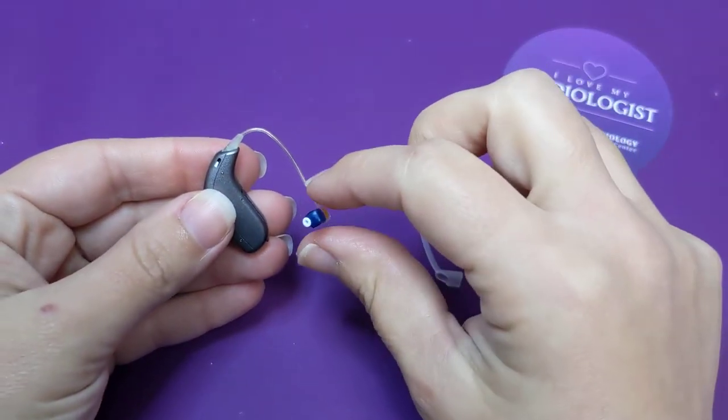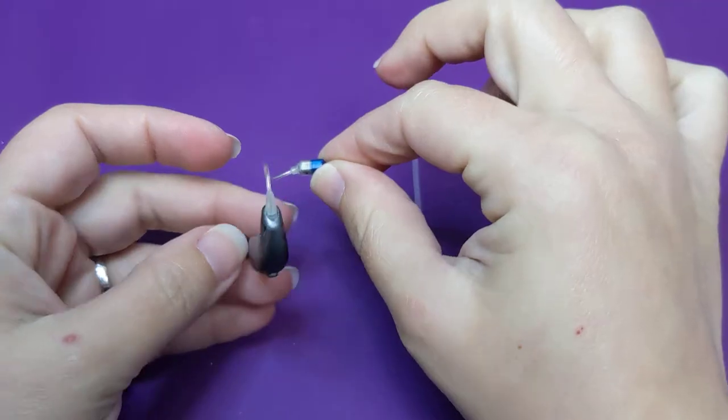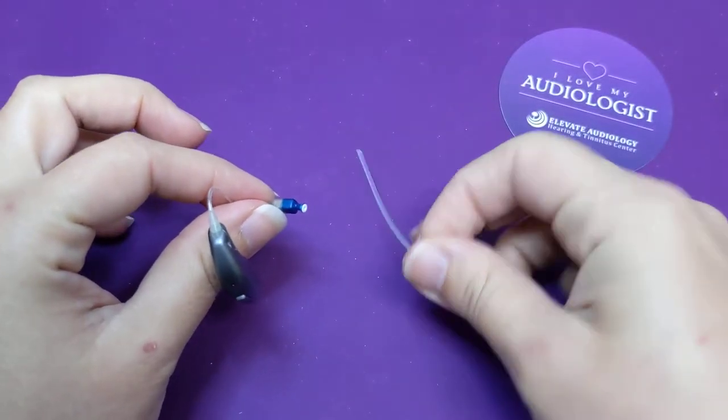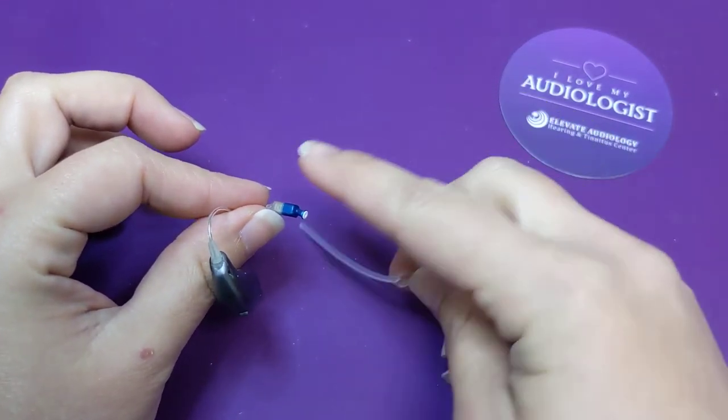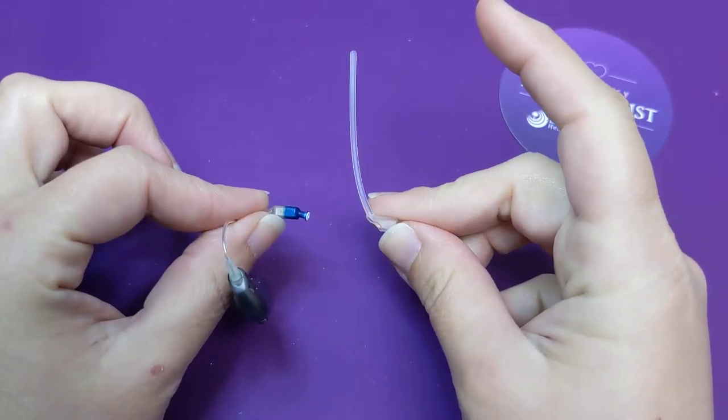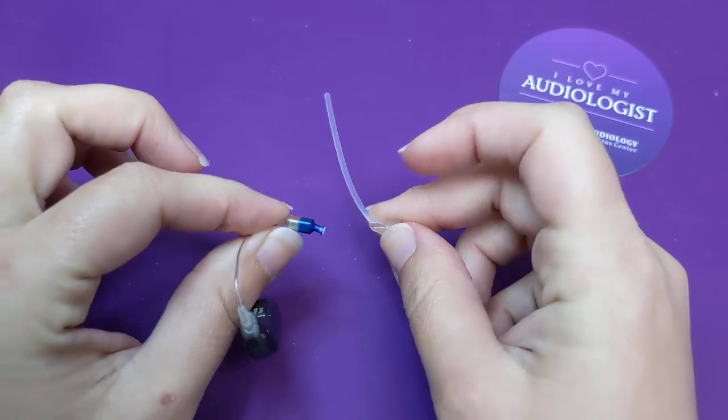So this would be the left side, it's blue as you can see. And so there are different size anchors for different size speakers. So this is the appropriate size anchor for an 85 decibel speaker.